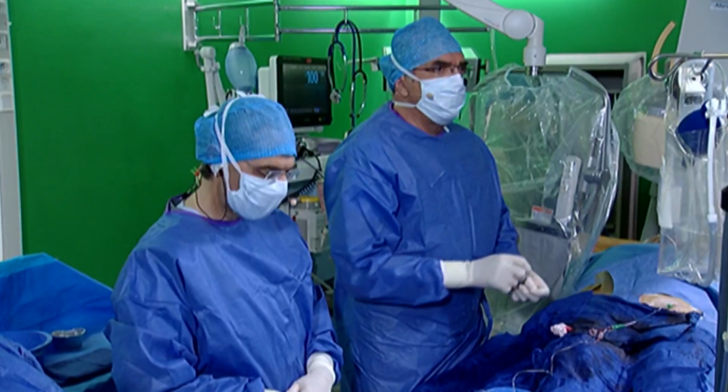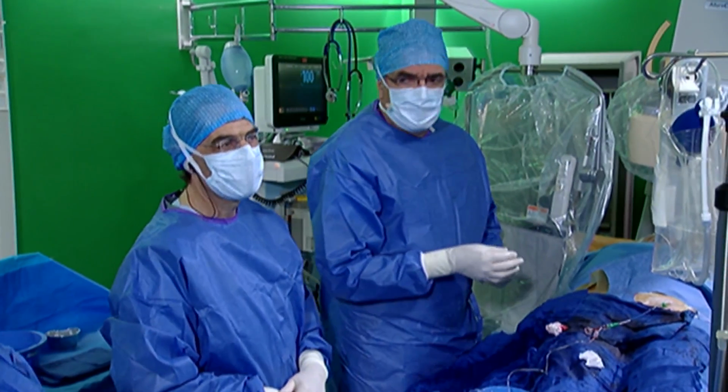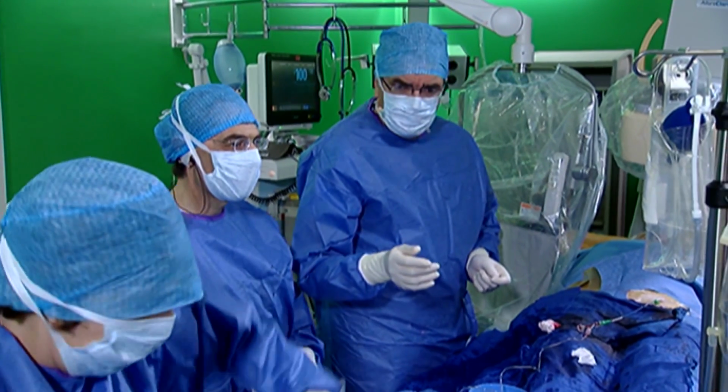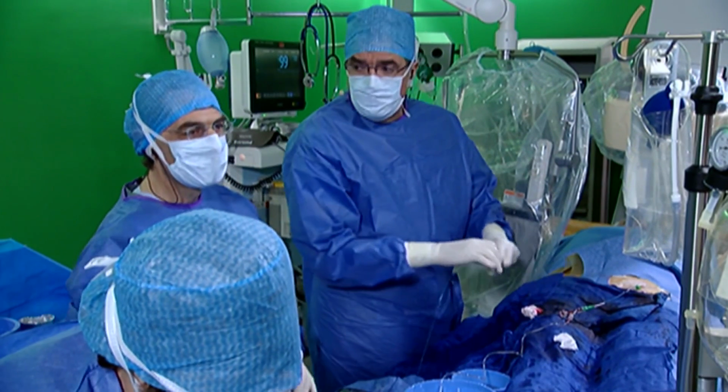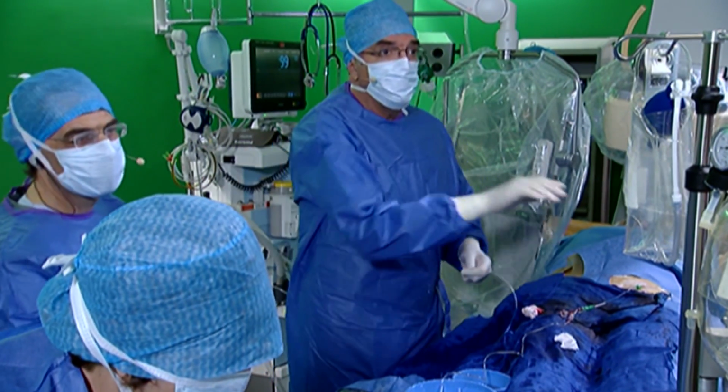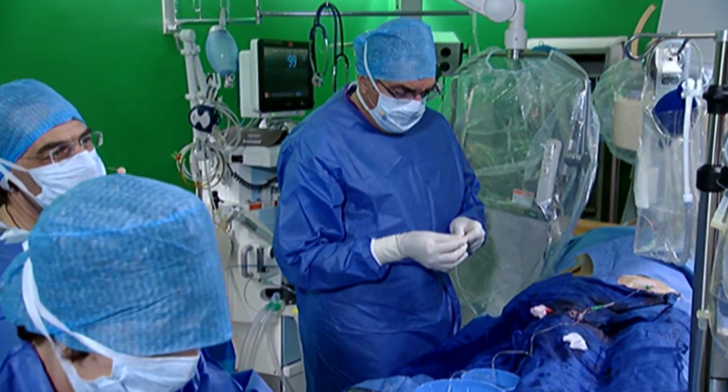Any questions? How significant was the left main by OCT? OCT significance by Giulio, you can.